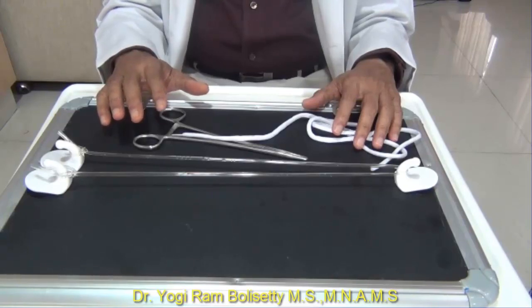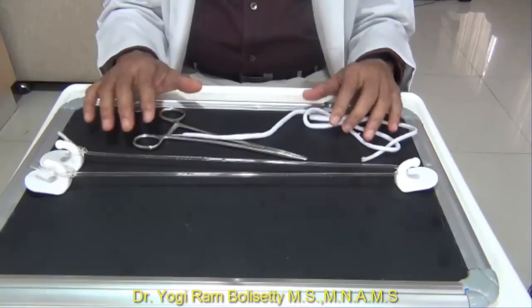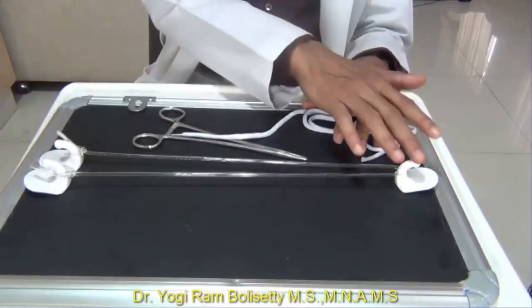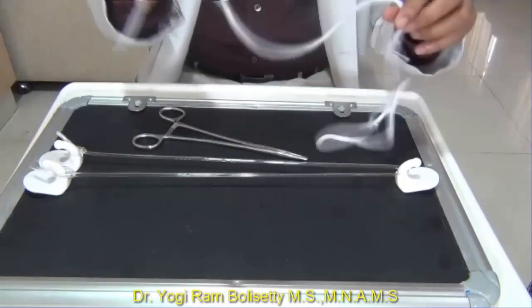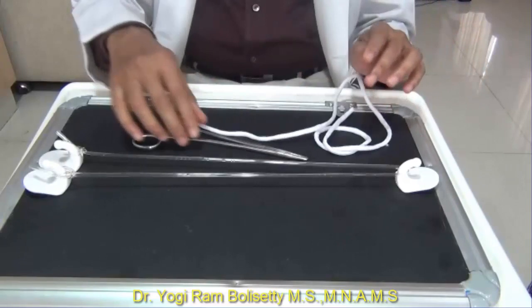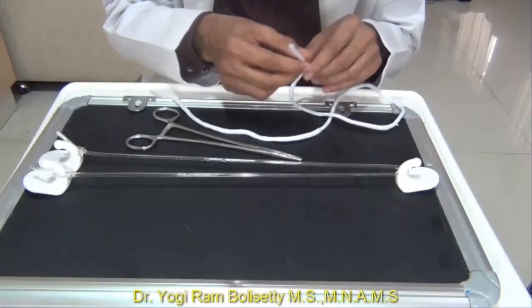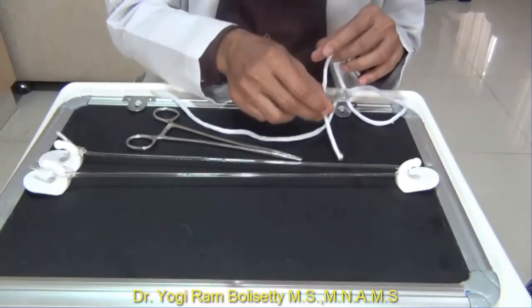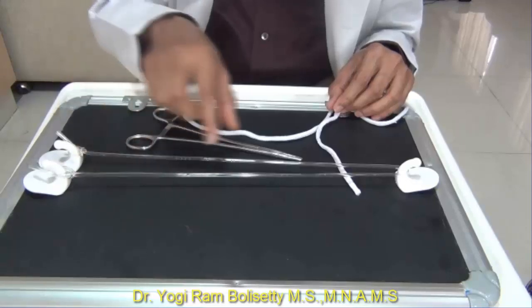Greetings from Sri Rama Hospital. This is Dr. Yogiram Bulisati demonstrating the method of making a reef knot and a surgeon's knot with the help of instruments. The materials required are a board with three coat hooks fixed using double-sided sticker, a suture material, and a needle holder. First I will demonstrate the method of making a reef knot.